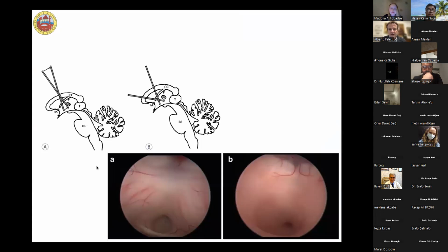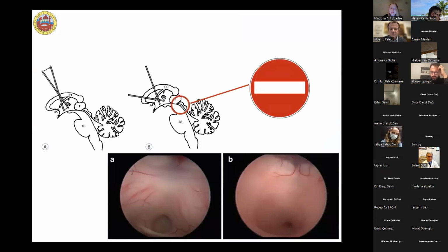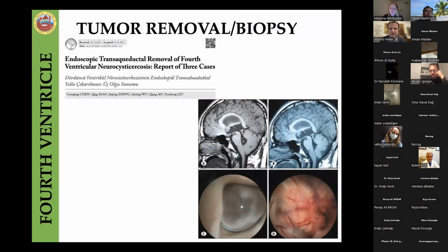And I think the cerebral aqueduct has been seen by neurosurgeons like the Pillars of Hercules for endoscopy. Even after the introduction of the rigid endoscopes, we can inspect this area but not cross. Otherwise, we can have very severe damages.